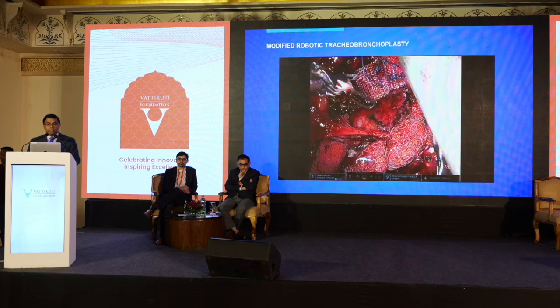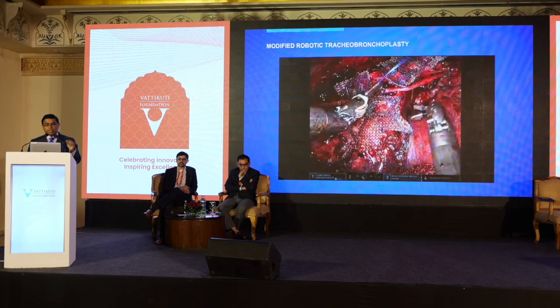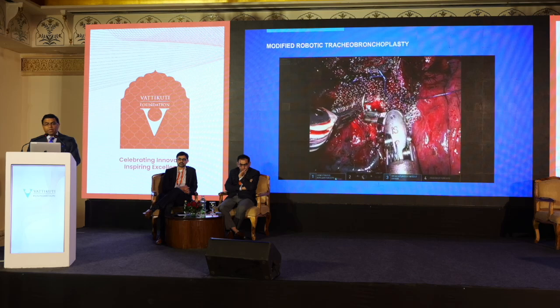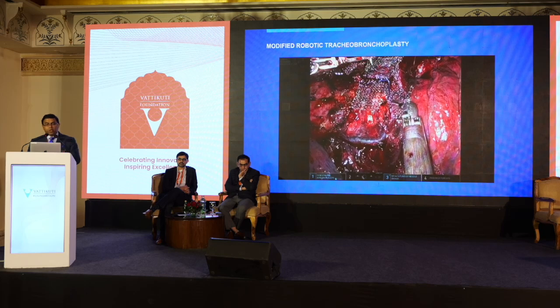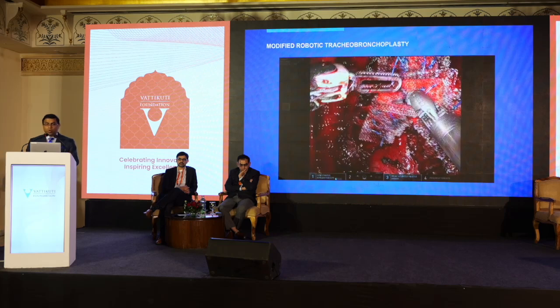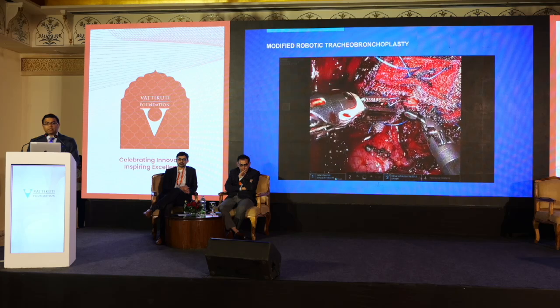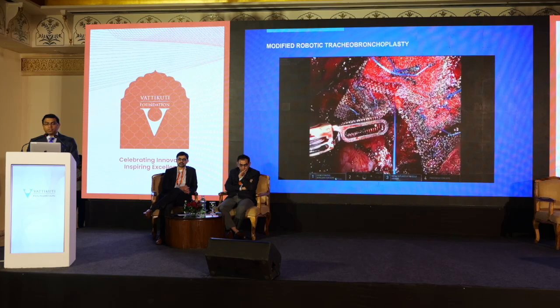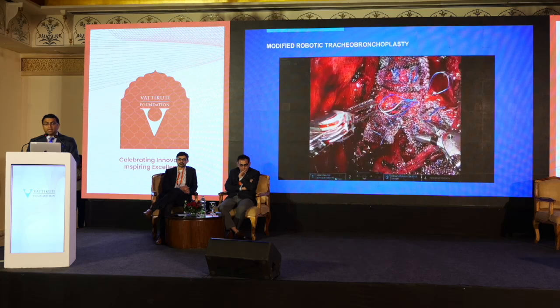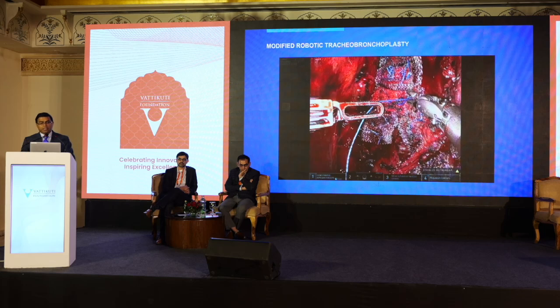And then I work my way to the right side, and this is the right main stem bronchus here, and the vagus nerve is the nerve that you see there. So work into the upper lobe there, and that's also another modification. I create this Y-shaped mesh. And so that is essentially the procedure, and I've simplified this to make it very easy and to be done in about 3.5, less than 4 hours overall, as we're getting better at this.